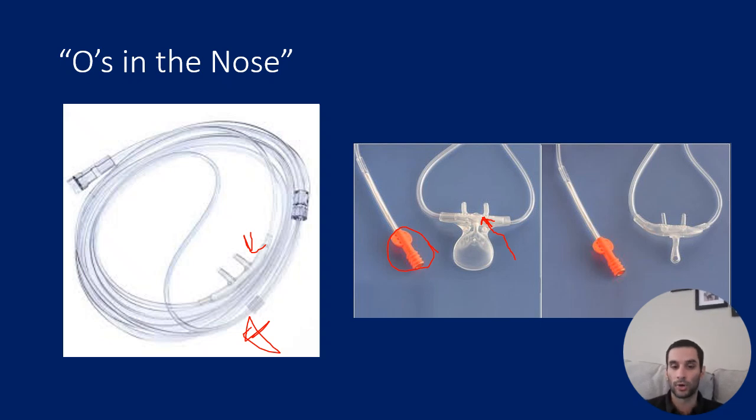So in a true emergency, a standard nasal cannula is going to get you better flow rate. Whereas if you need end tidal, as you might in some ALS scenarios, then you might have to use one of these and use other methods. But just know that you're not going to be able to blast oxygen with an end tidal nasal cannula setup because the holes are smaller where the oxygen comes out.